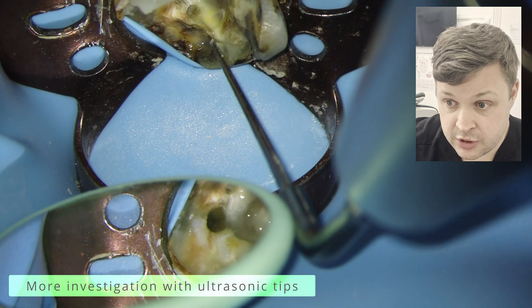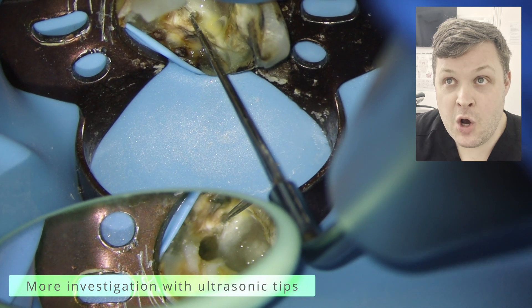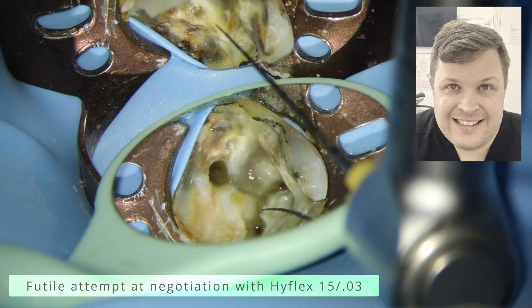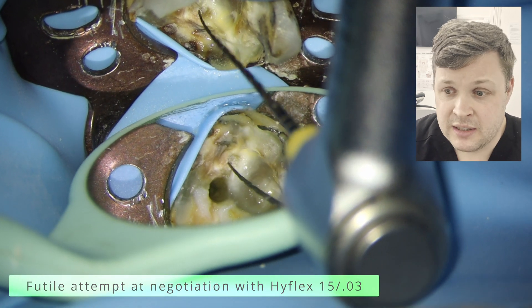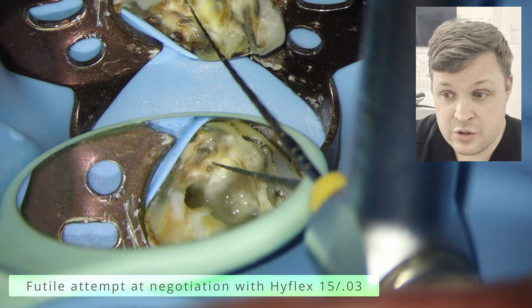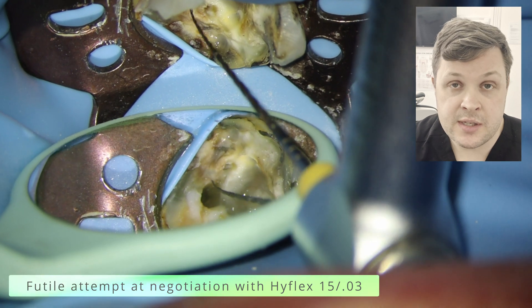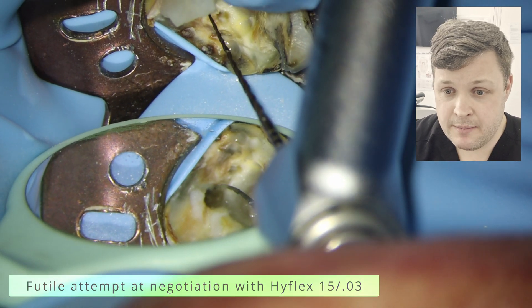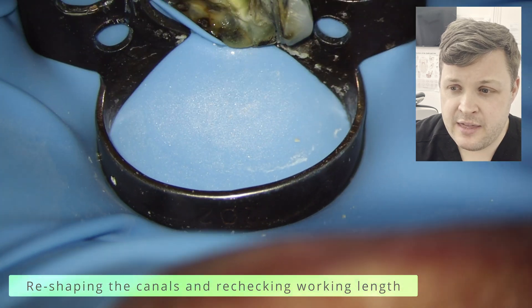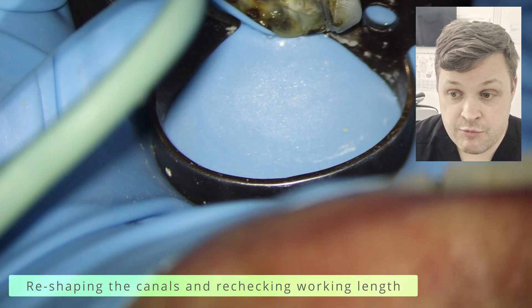The worst thing to do, of course, is to perforate the tooth. I could do a cone beam CT scan, but in the moment you have to make a command decision. I'm using a glide path rotary file very carefully — this can cause file fracture so you have to be really careful. I cannot find the supposed second canal, so I'm going to abandon that search and recheck the working length on all canals, since they were all a bit short. We'll re-prep the canals where the working length was incorrect.